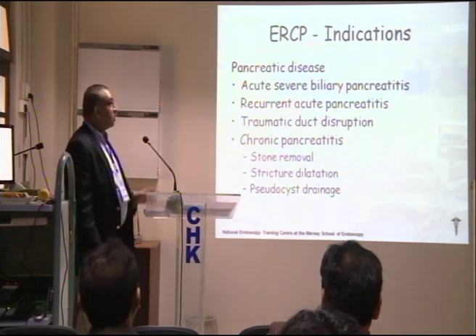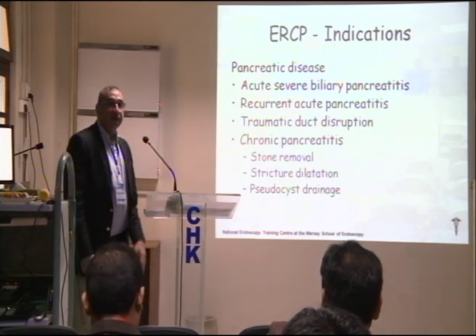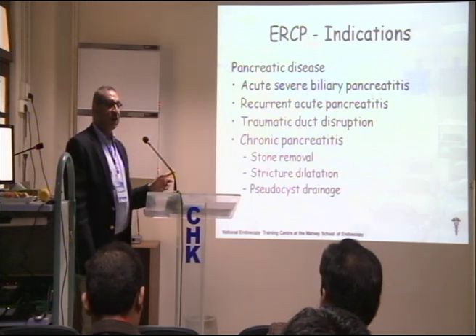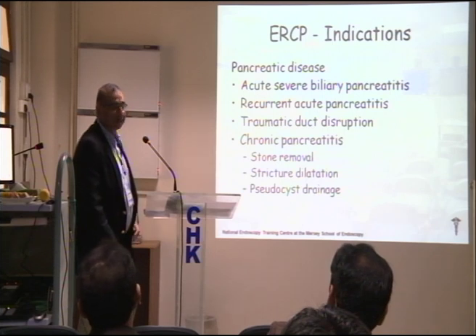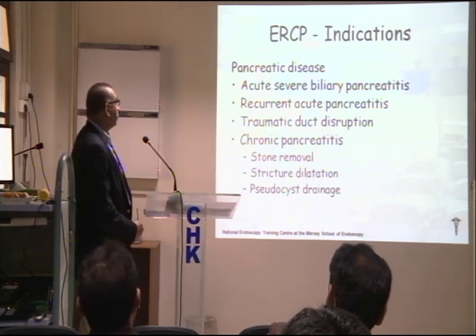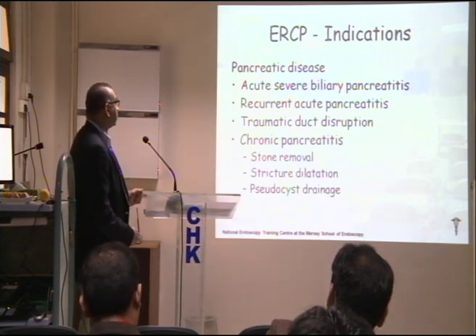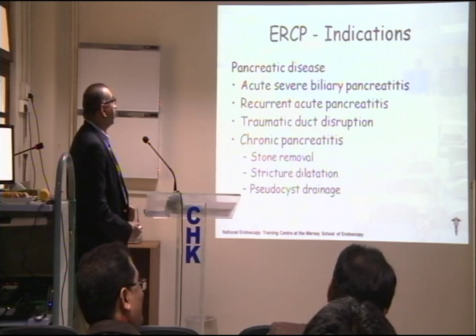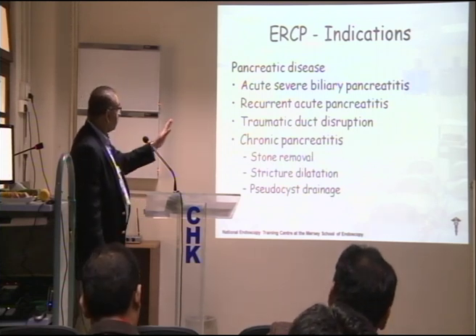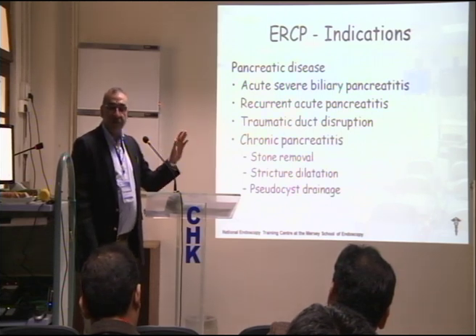Pancreatic disease. Well, one thing I should mention before we go through that is that you people are not going to do ERCPs for pancreatic indications, full stop. It is something which is specialized and should be done by people who are experts, right? So any pancreatic work should be sent to Dr. Sadnyas. That will increase his workload.